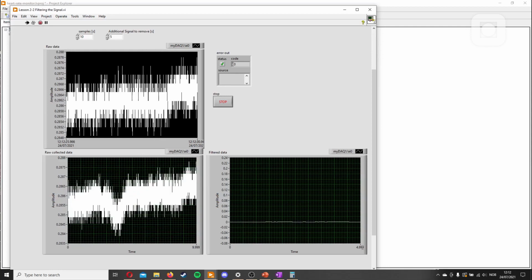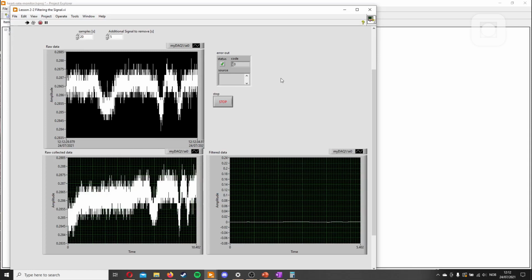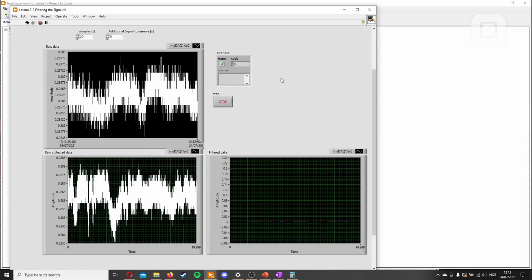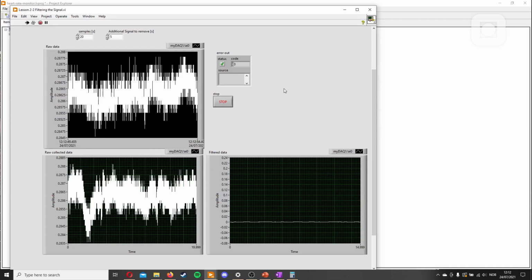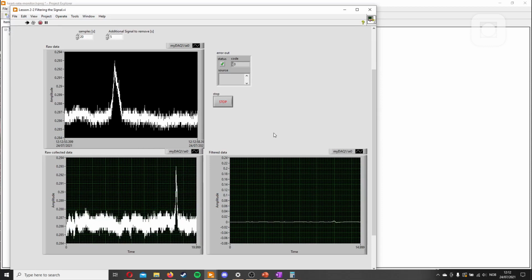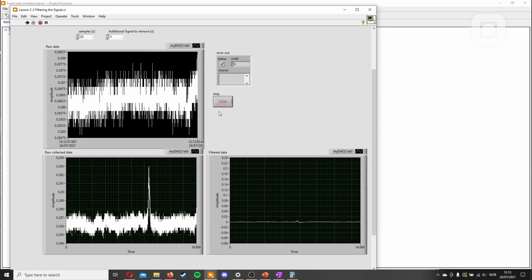We got half the signal length, but that doesn't matter because we can just increase it here. The filter takes the same amount to stabilize regardless of the length of the signal. So this works out fine. But 5 seconds is a lot of time, so let's try to minimize it with some fancy technique.